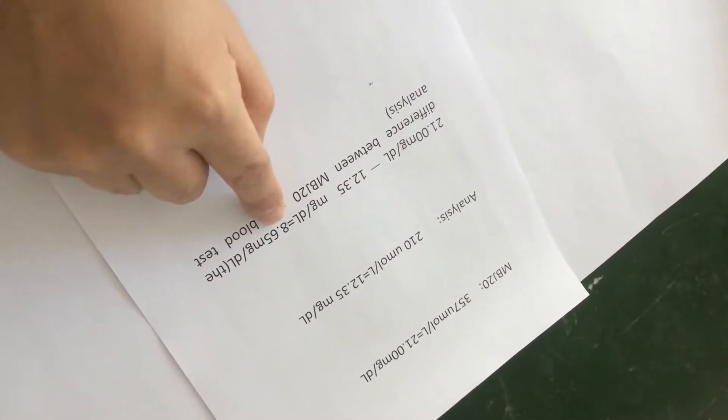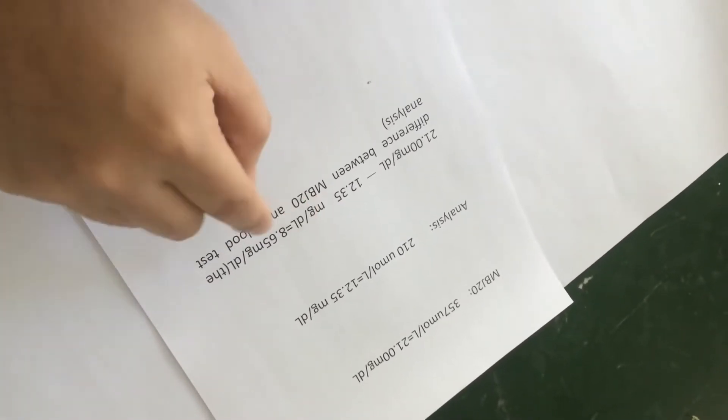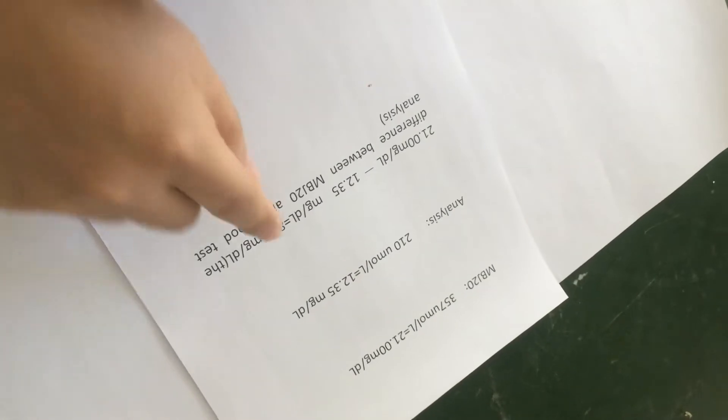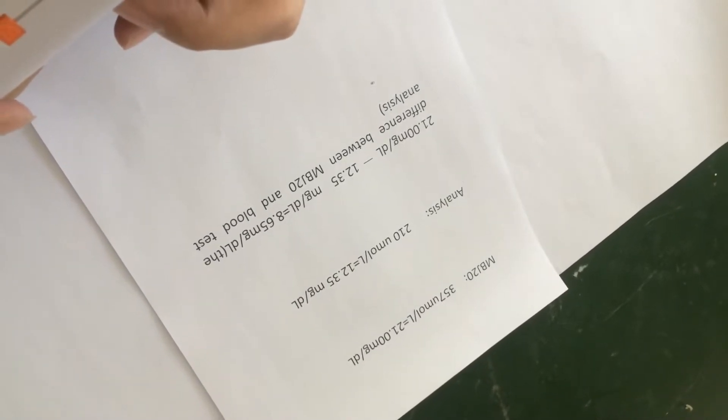The difference is 8.65 MBD. This is the number we can see — your number is higher. So we must reduce the number, reduce the difference.